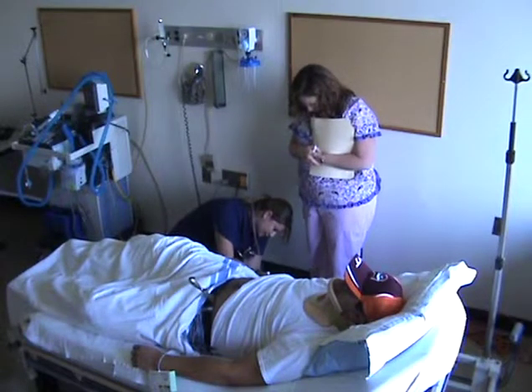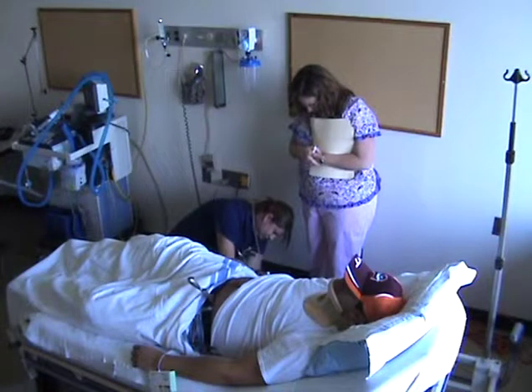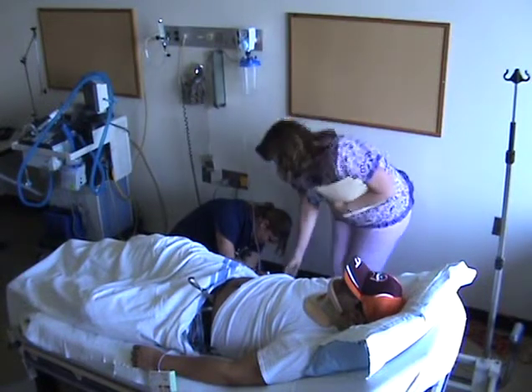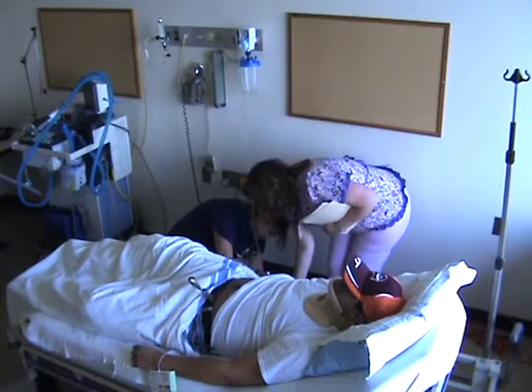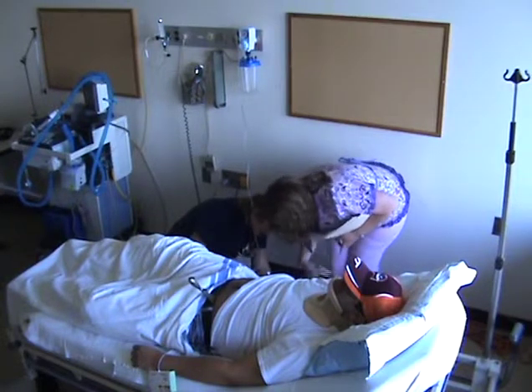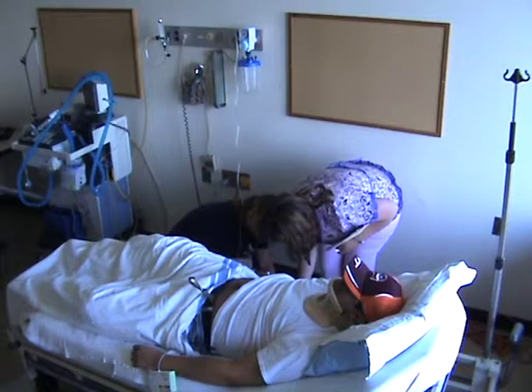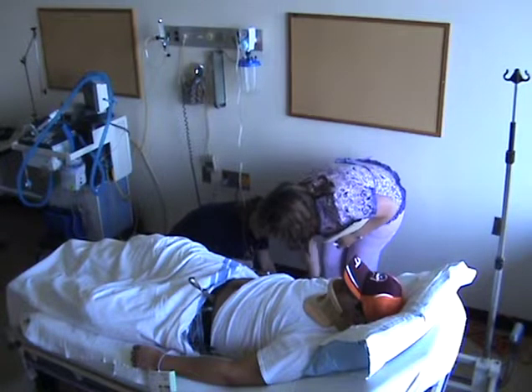And then make sure that you've got suction. Yeah, and you know you've got suction if you see the bellows in the window, and you've got it dialed to the proper setting. Another thing you have to do is put the water in the water seal when you set up the new one. Your water's back here, but we couldn't figure out how to put it in there, so we're just going to skip that. We'll have to ask Susan on that.